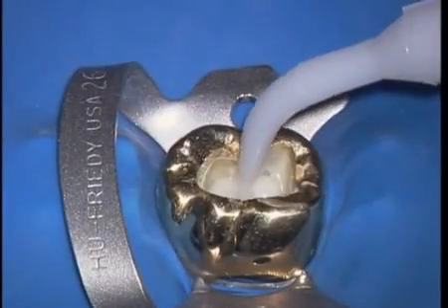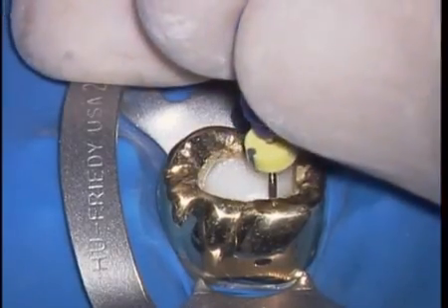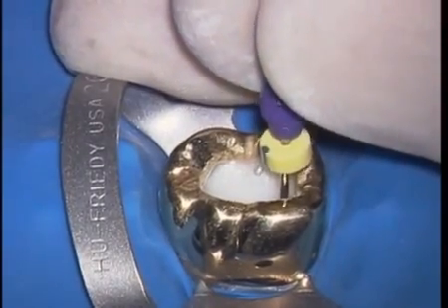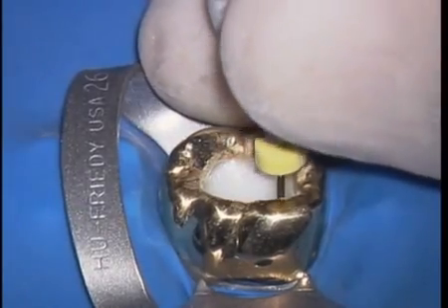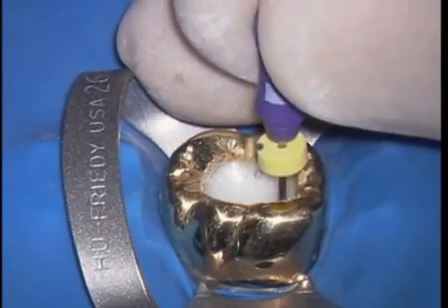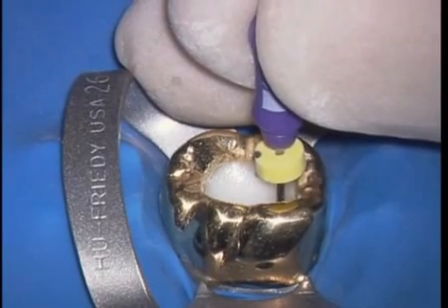After pre-enlarging the portion of the canal coronal to the block, top off the tooth with a viscous chelator. A pre-curved 10 file is used as an explorer. Unidirectional stops allow the clinician to intentionally direct the file in different vectors or pathways. Use short vertical amplitude strokes to move chelator progressively deeper into the canal. If you get a stick or feel a tacky area, that's the place to be.